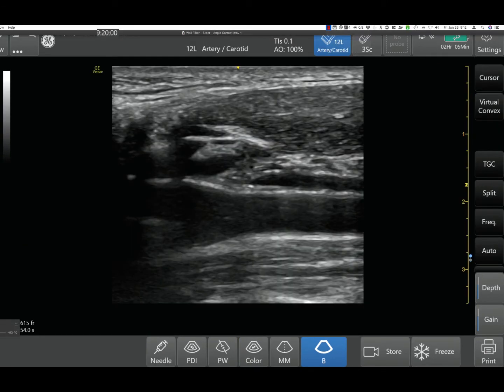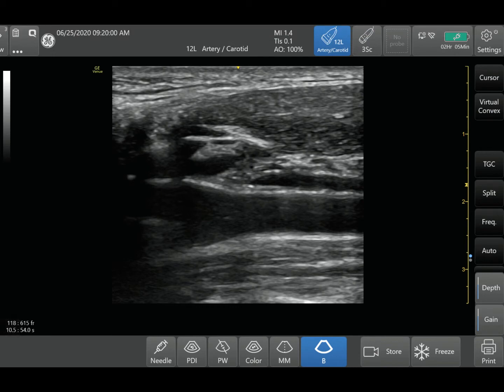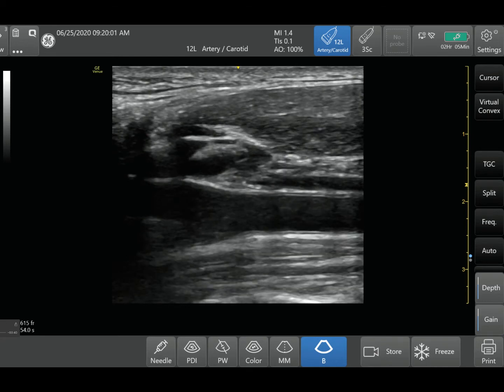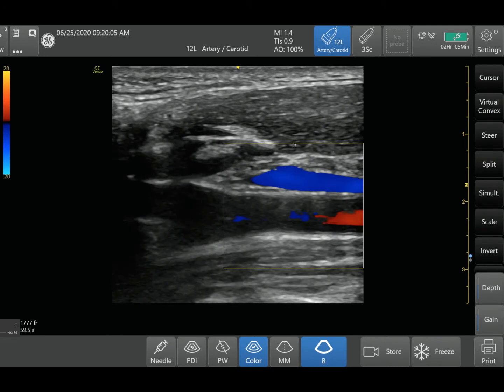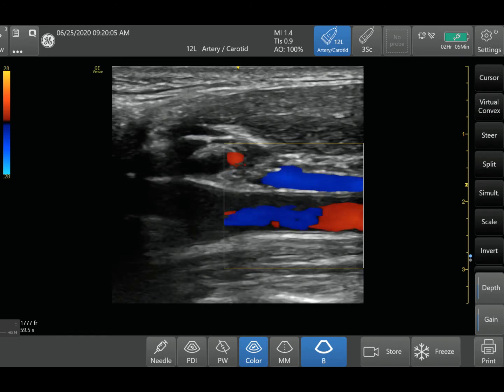The next concept is called steering. Steering is a function you can use with color Doppler when you're using a linear probe. When I have a linear probe and activate color Doppler, the box looks like a square box. As we know, you want flow to be either going towards or away from your probe. When flow is perpendicular, you're not going to be able to detect good Doppler signals — that's where you're going to see a lot of mixed blues and reds.